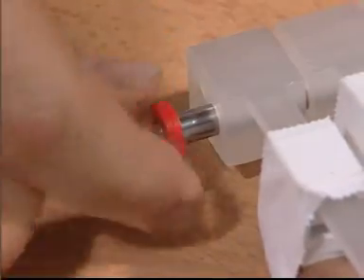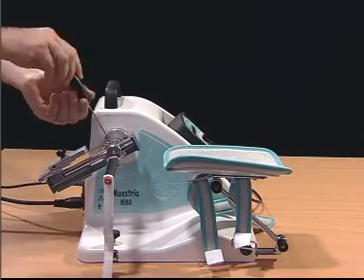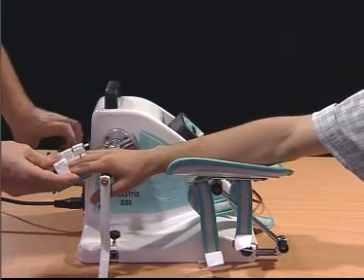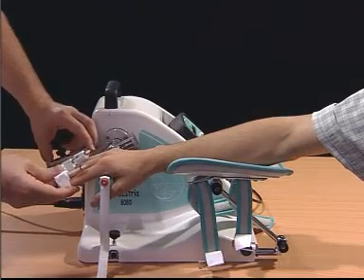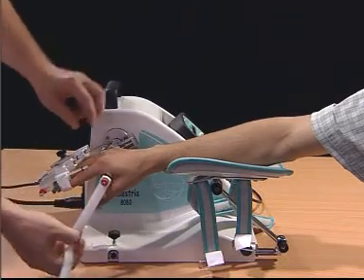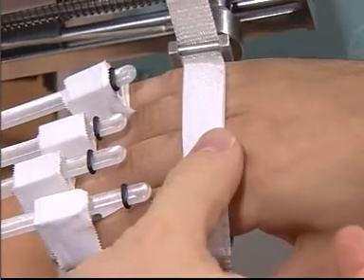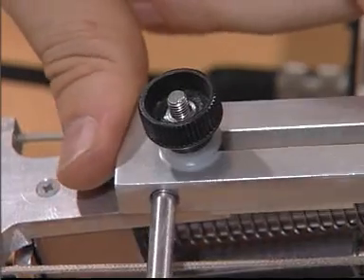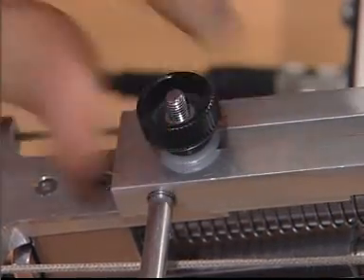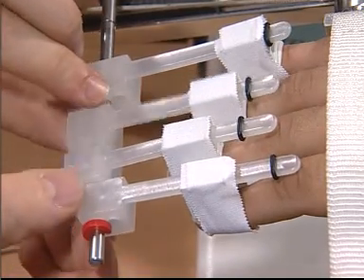We secure them all in place. We use the pivoting bar as a palmar support. We attach the drive bar onto the trainer. We secure the patient in place. Proper space is provided for finger tracking.